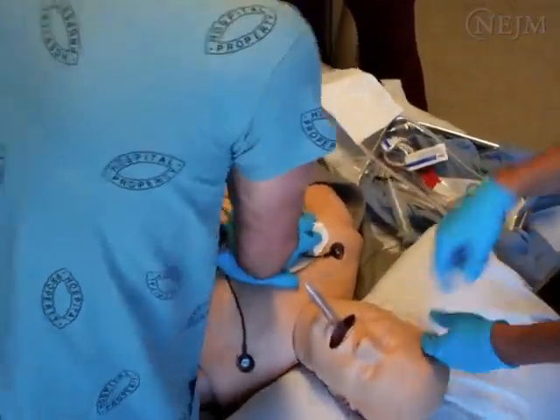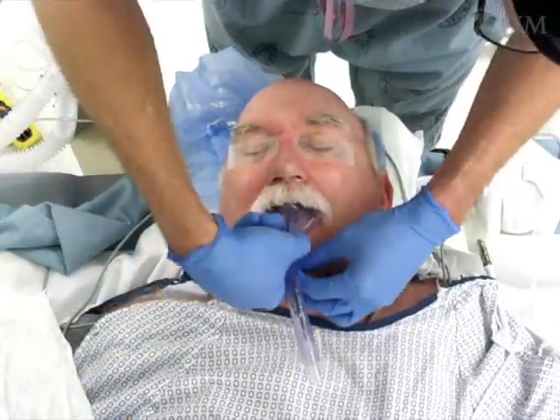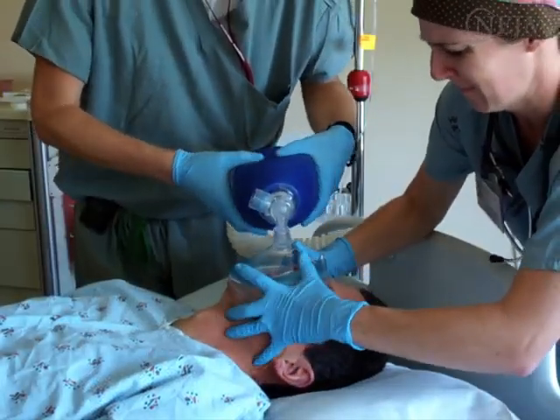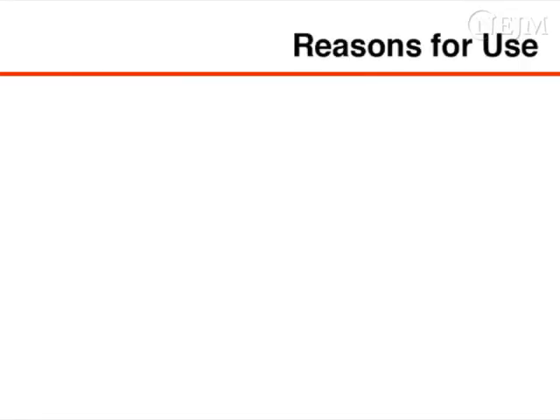The laryngeal mask airway is also an important rescue device in situations where tracheal intubation is impossible or has failed, and in situations where access to the head or positioning for intubation is not possible. Use of laryngeal mask airway instead of bag and mask ventilation during CPR has also led to fewer events of pulmonary aspiration during resuscitation.